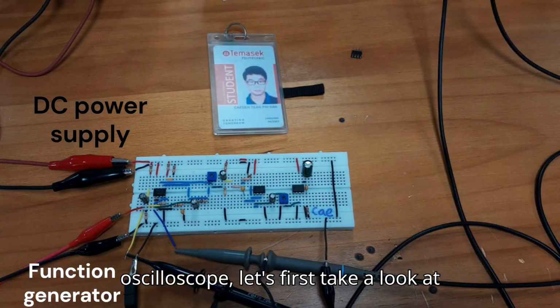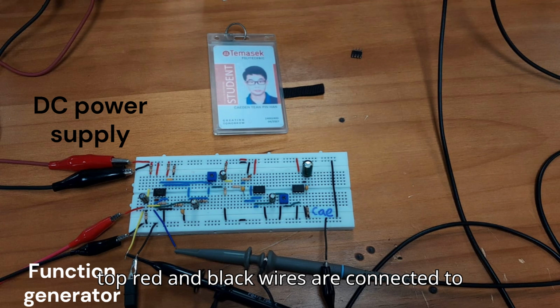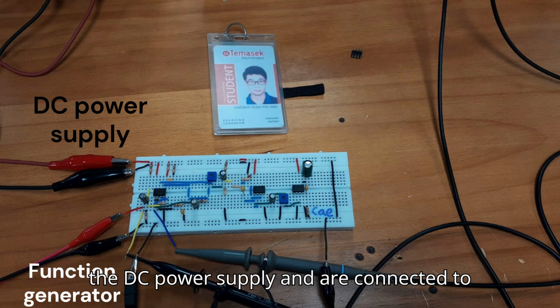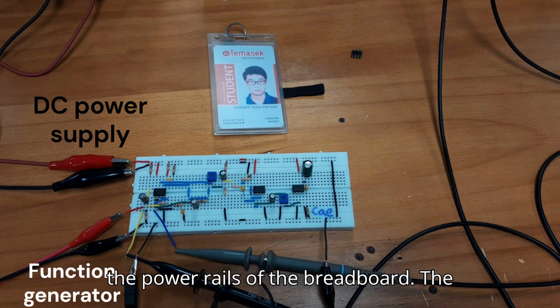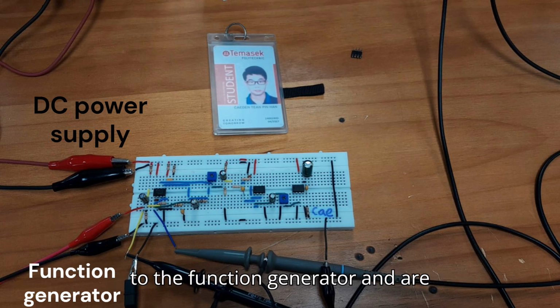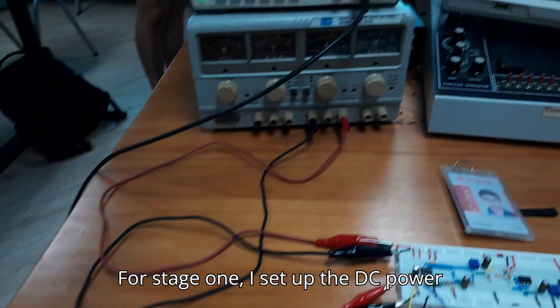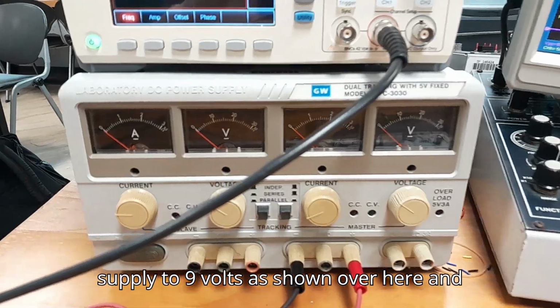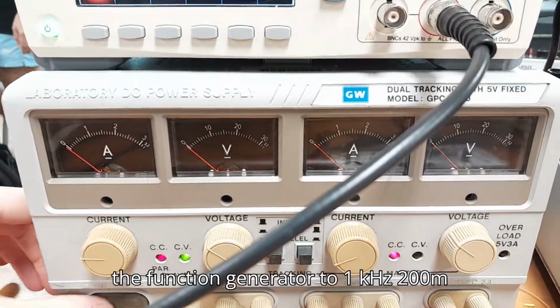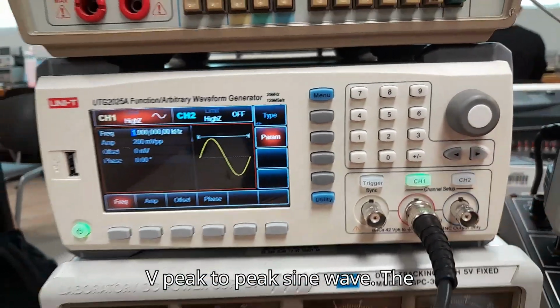Before we take a look at the oscilloscope, let's first take a look at how the power supplies are connected. The top red and black wires are connected to the DC power supply and are connected to the power rails of the breadboard. The bottom red and black wires are connected to the function generator and are connected to the positive for C1 and ground. For stage 1, I set up the DC power supply to 9 volts, as shown over here, and the function generator to 1 kHz 200 mV peak-to-peak sine wave.